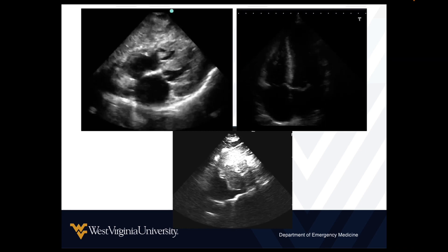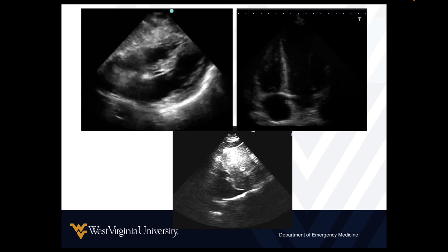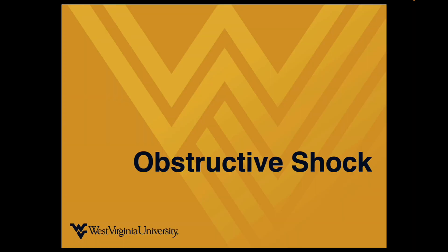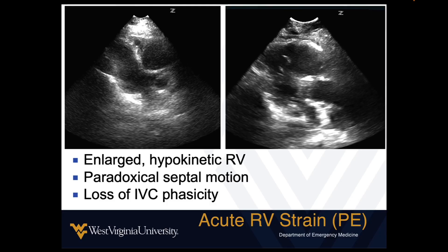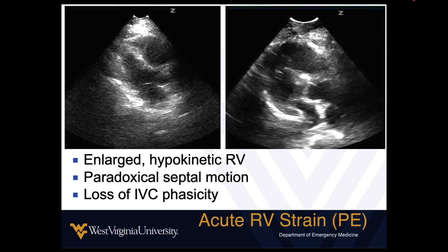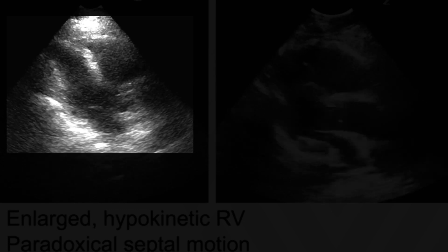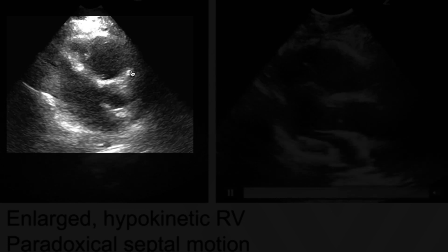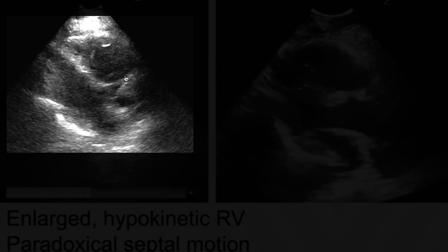This is the typical physiologic appearance of hypovolemic, hemorrhagic, or distributive shock — assuming the patient has a baseline of pretty normal physiology. Now, obstructive shock — what's that going to look like? One form of it, if it's from a massive PE, you're going to see a big, giant right ventricle that compresses the left ventricle. That's the main thing to remember.